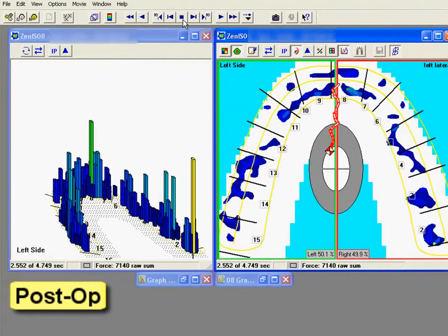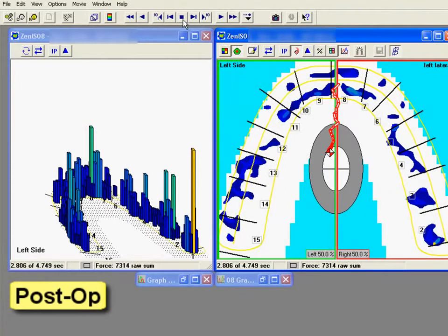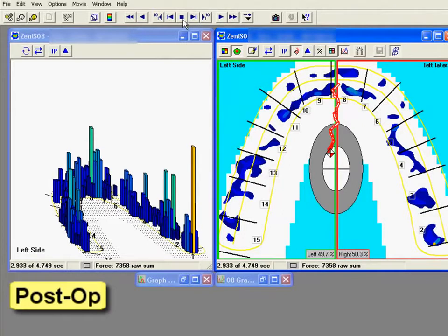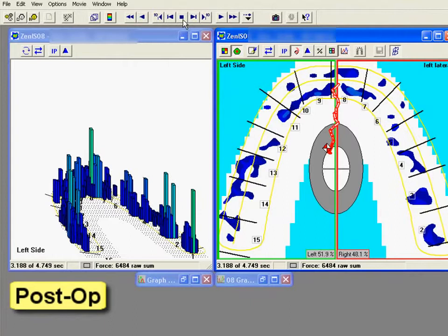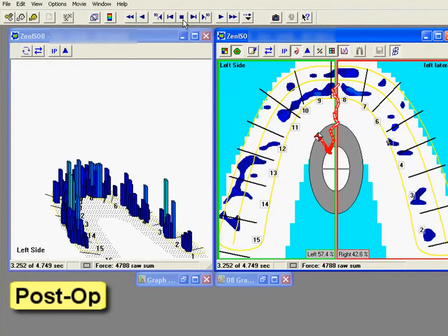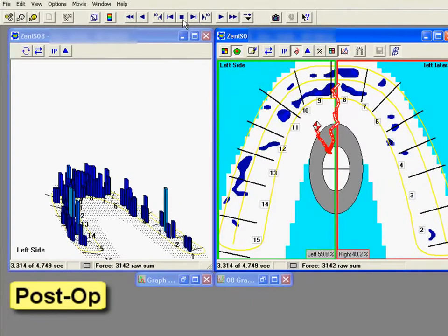After reducing the disclusion time, the T-scan data shows the patient occluding and the bite has been balanced to nearly 50% right to left. It takes the patient less than three-tenths of a second to reach anterior guidance after the excursion begins.